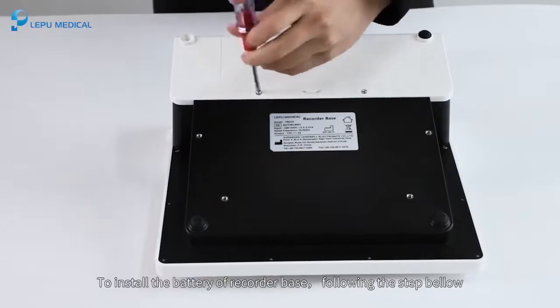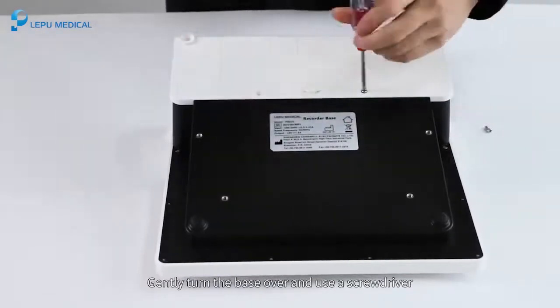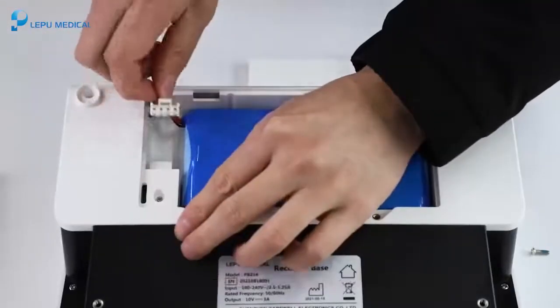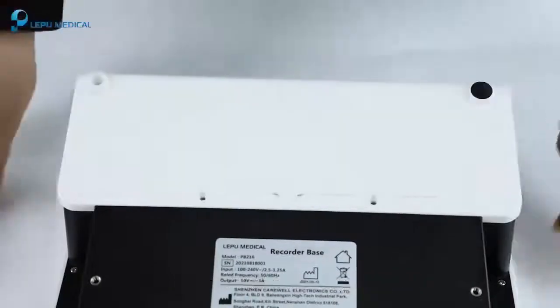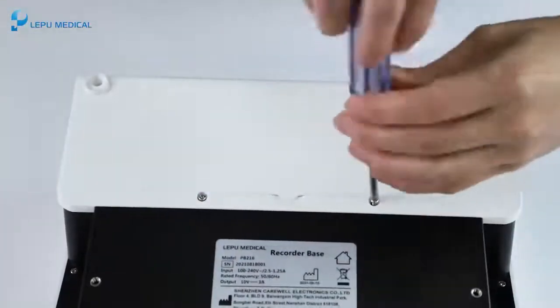To install the battery of recorder base, follow the steps below. Gently turn the base over and use a screwdriver to remove the fixing screws on the battery compartment cover. Connect the battery plug firmly to the socket on the recorder base, then insert the battery into the battery compartment. Close the battery compartment cover and tighten the fixing screws.